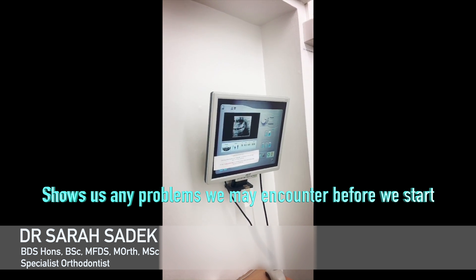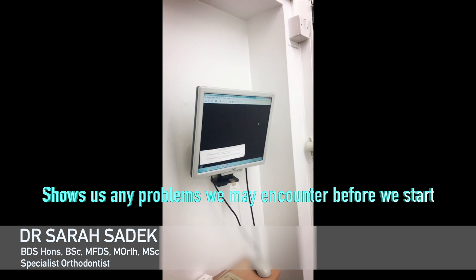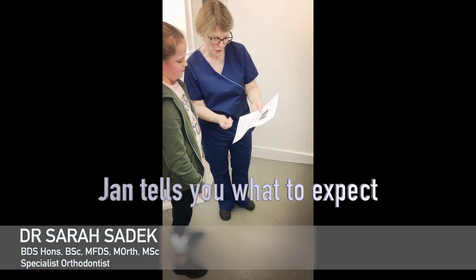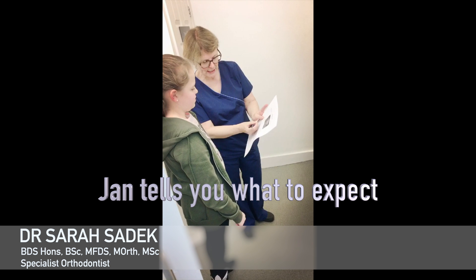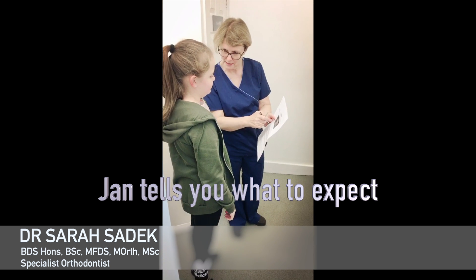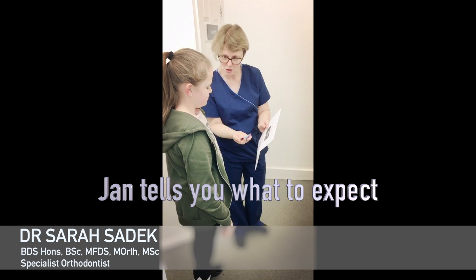As we can see, the x-ray pops up immediately as it is a digital x-ray. Our friendly Nurse Jan then goes through what you can expect when you have your brace fitted, so you can have a little read of that before you come in. These tiny little elastics go around your brackets and hold your wire in. You can choose a colour for today, and then every time you come to see us every six to eight weeks, you can change the colour. You can even have two colours.